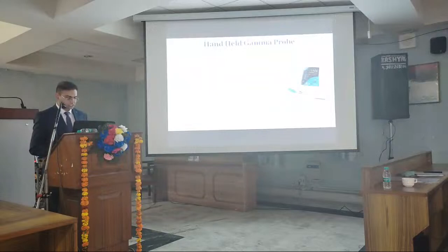By using this probe, if we find any focus of radioactivity which is 2 to 3 times the background activity, we consider the rays to be coming from the sentinel lymph node.